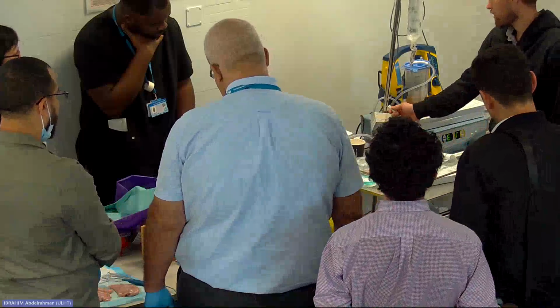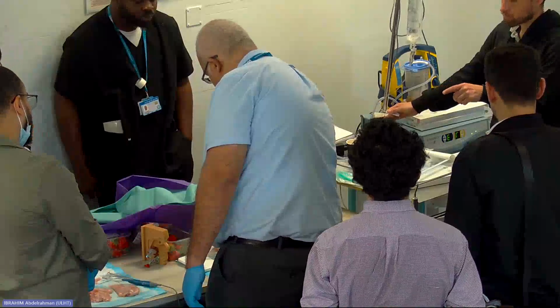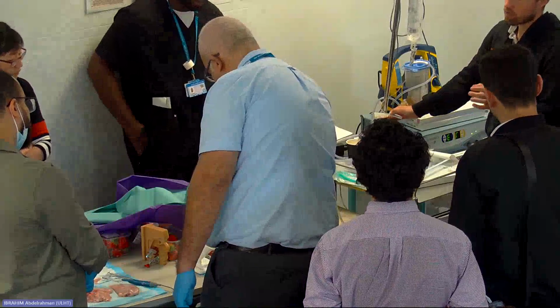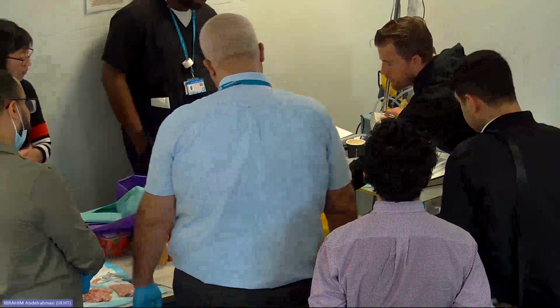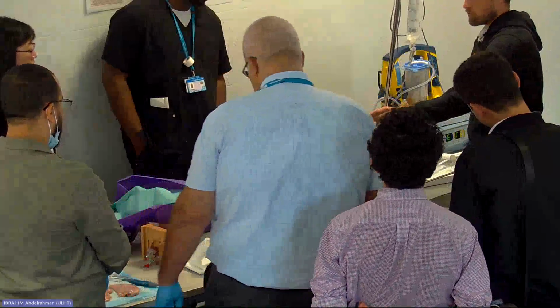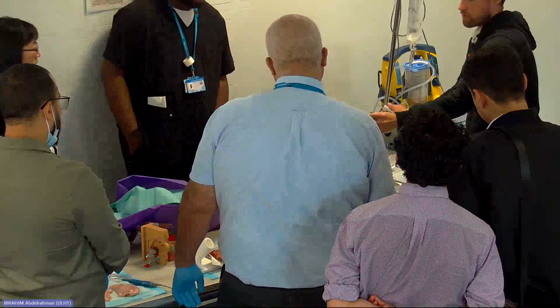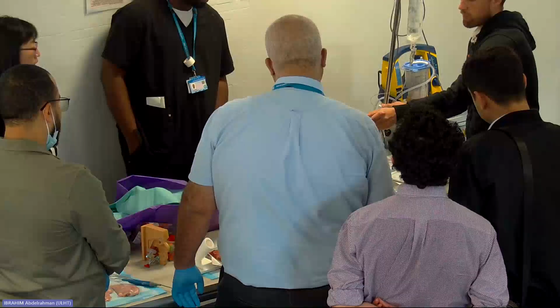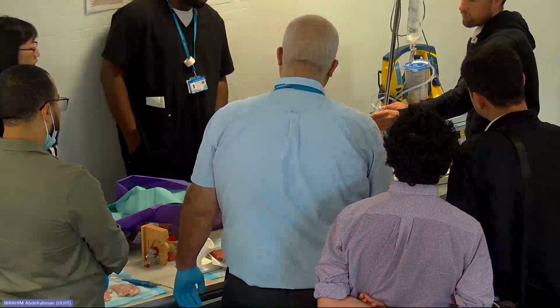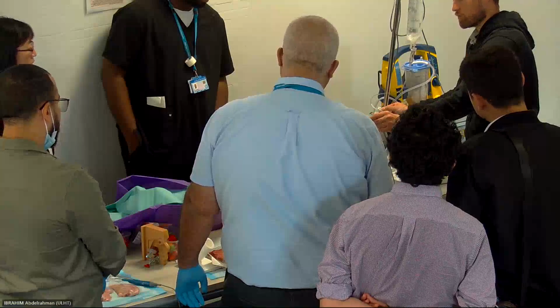But then the last thing to do is set your flow rates. Now this is the other really important thing in terms of balance and correctness. If I hold the wand here, and one of you puts your foot on the pedal, you see it steams quite a lot. Hold it this way, it drips a lot more. Hold it this way, it steams. Hold it that way, it doesn't drip very much at all.